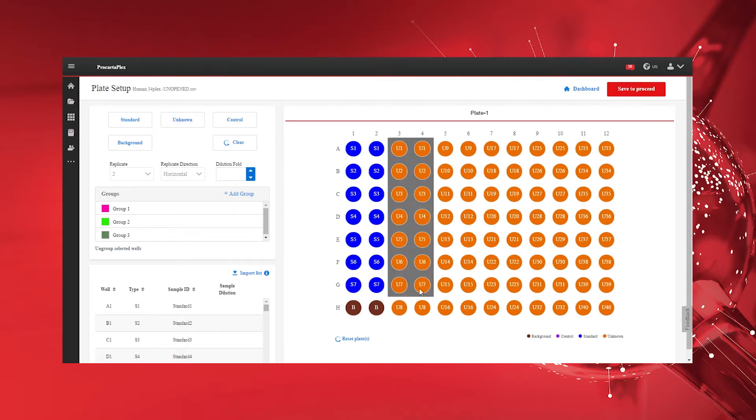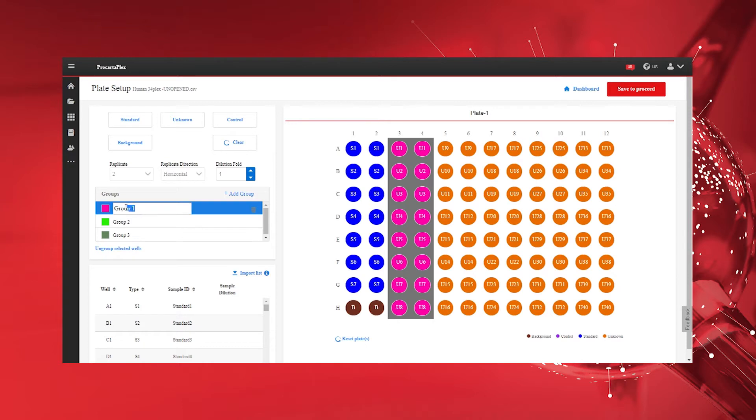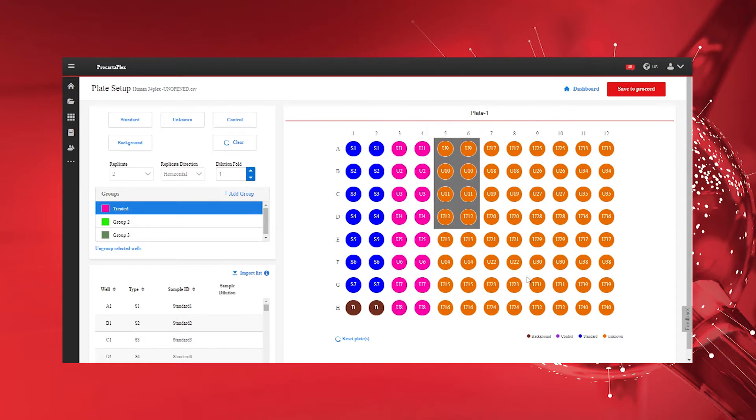If necessary, assign unknowns and control wells into specific groups for group-wise statistical comparison in the results page.